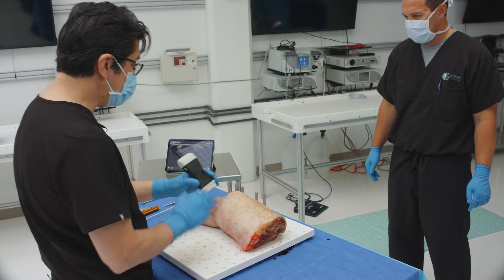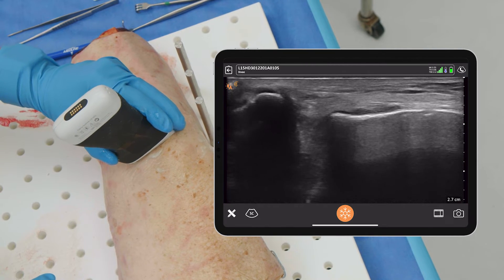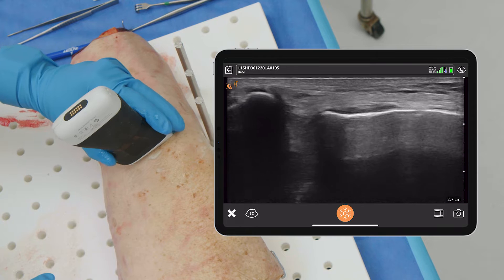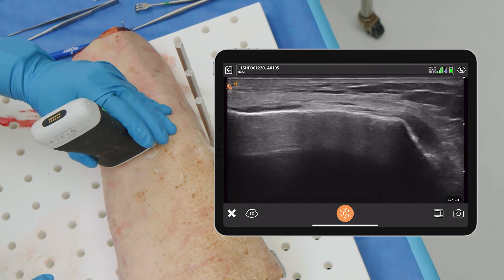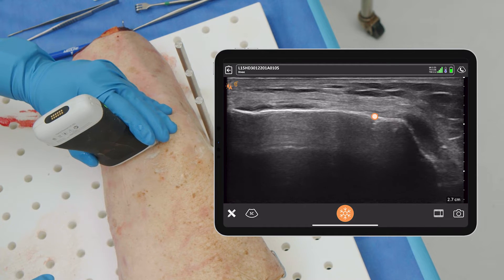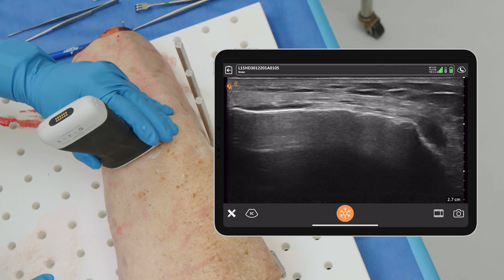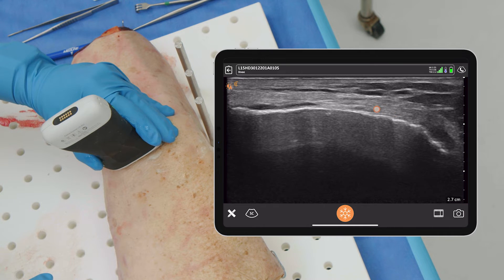The first key point is knowing where you want to look. If we come proximally, you can see the patella and the MPFL right there. As you follow it distally, you want to follow it to its insertion point. What you're looking for is the adductor tubercle. We want to be a little bit proximal and slightly anterior — and that's actually the insertion point of the MPFL right there, which looks quite good.